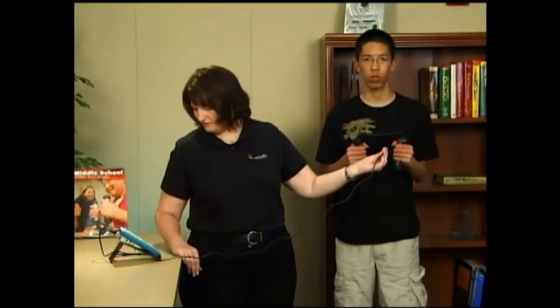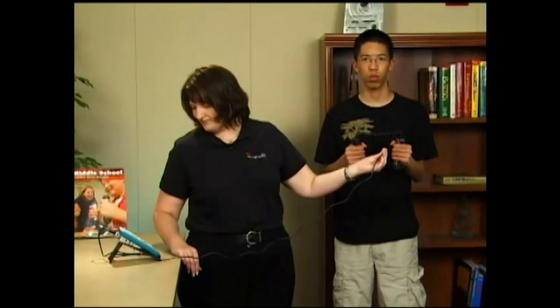OK we're just coming up to the end of our four minutes in the standing position and we're just about finished. OK data collection just finished and thank you.